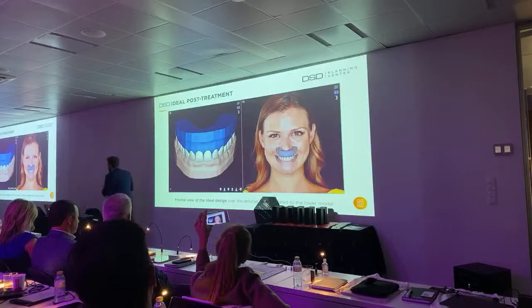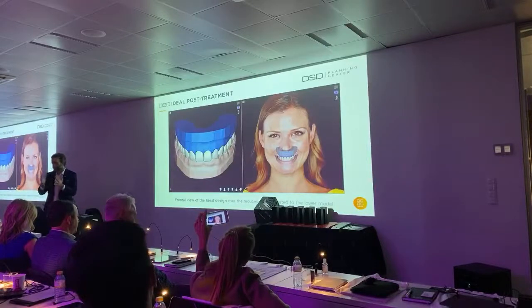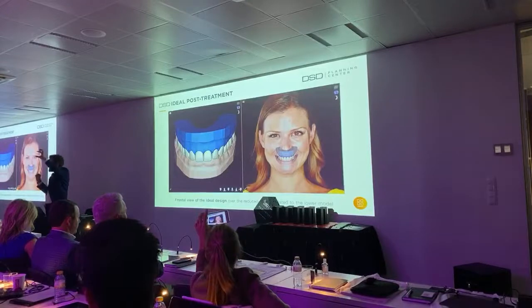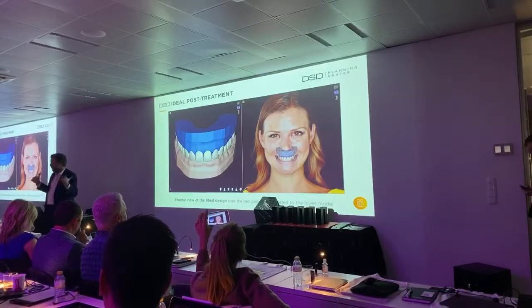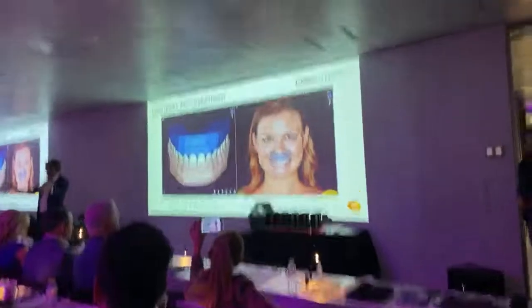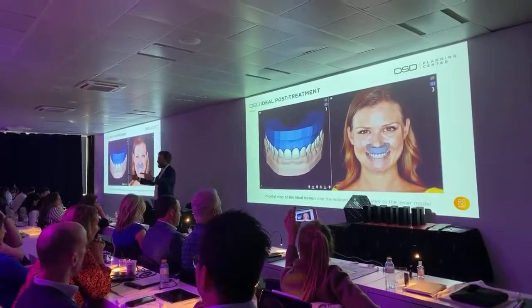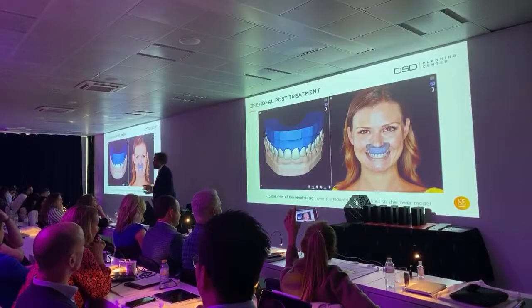So for ortho cases, since the case is going to ortho, you don't even need that level of precision. If it's a purely restorative case, it's different, I understand. You want to see the measures, you want to see crown lengthening exactly how much we are suggesting. But with ortho, you're still going to have to do ortho, and then after ortho, you're going to redo the design, and then we're going to fine tune and go into details. So it was causing much more confusion than helping.